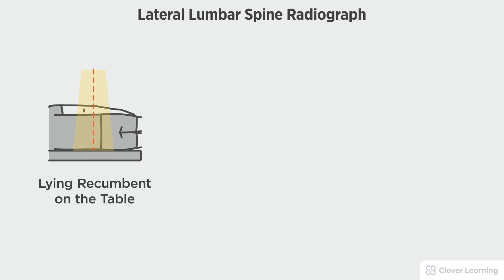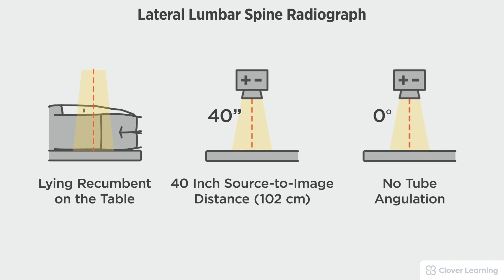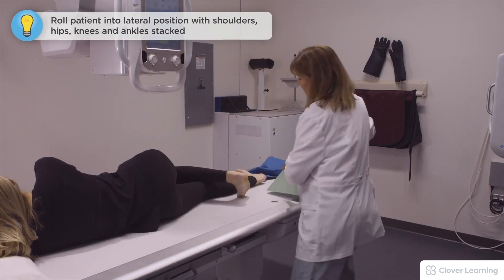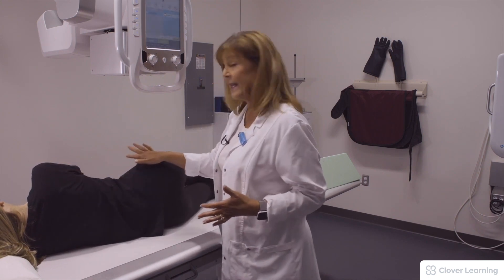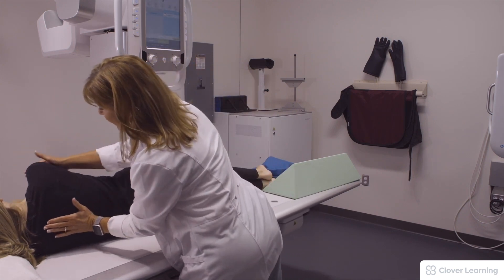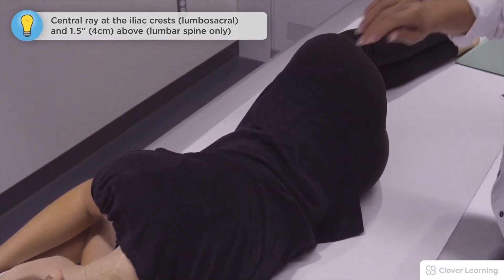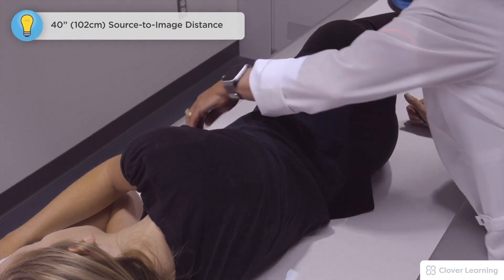In this view we will be demonstrating the lateral lumbar spine. The lateral lumbar spine should be performed with the patient lying on the table with a 40 inch source to image distance and no tube angulation. We want to make sure our patient is in true lateral position — shoulders stacked, hips, knees, and ankles aligned. We push her forward to ensure her back is straight. Our central ray is at the crest or an inch and a half above, using the coronal plane. She's on her left side so I'll use the left marker anteriorly and have her exhale.